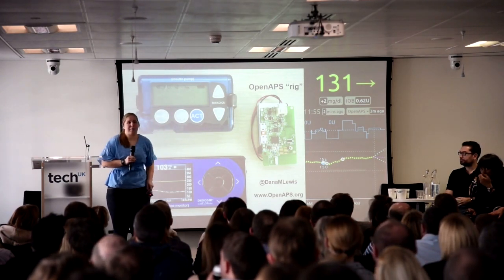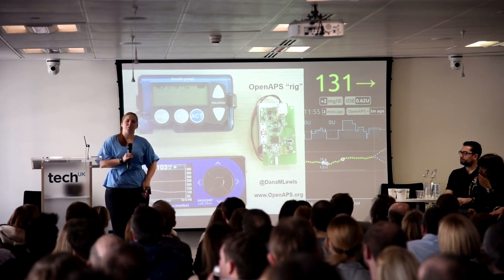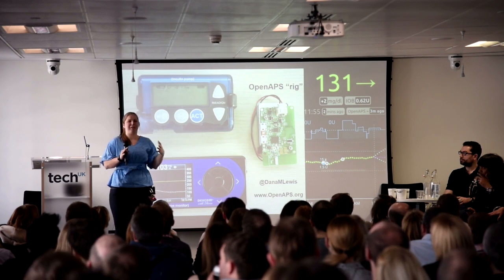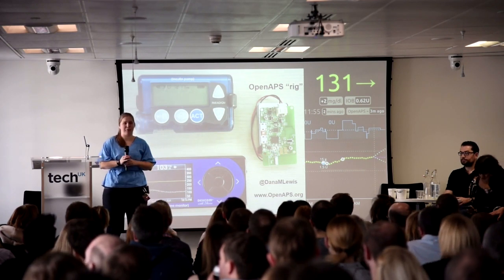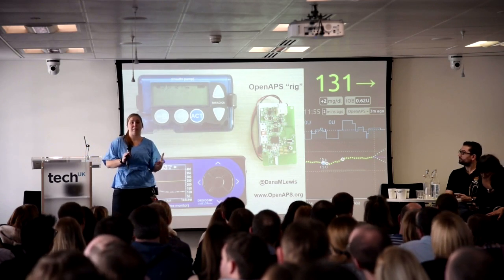And a lot of times people don't even notice that I'm wearing it. I've been asked if my phone battery, in fact, was my artificial pancreas, because people don't know what to expect when you say artificial pancreas or DIY closed loop. I've also got on the right side a picture of one of my Nightscout graphs, just so you can see some of the visuals of what I can see.